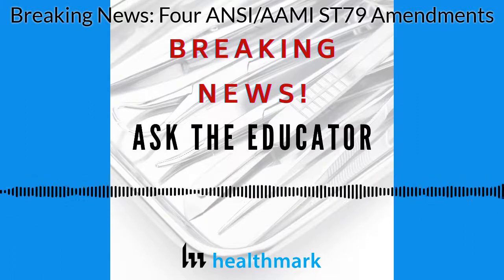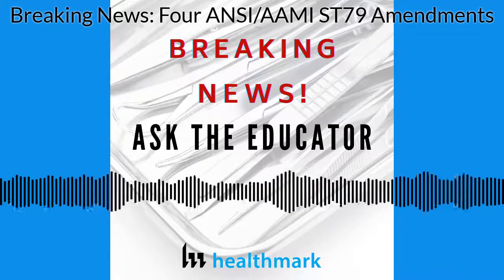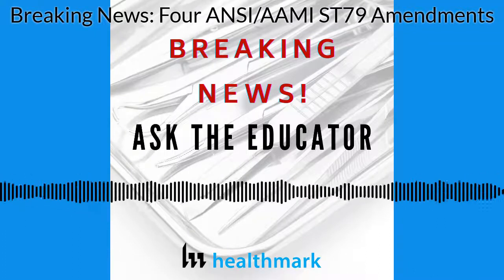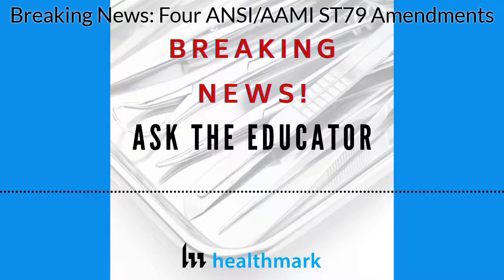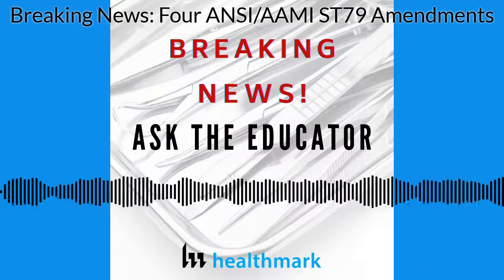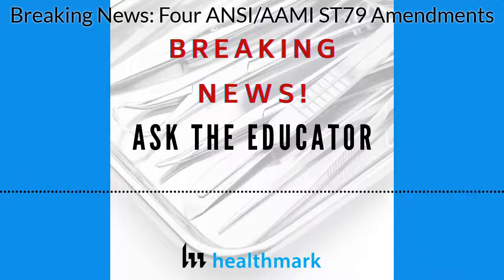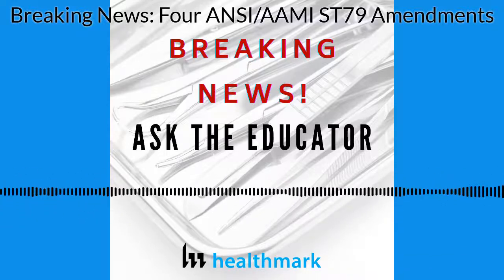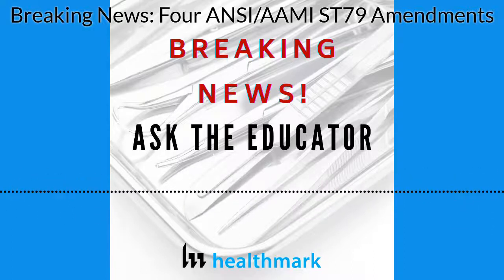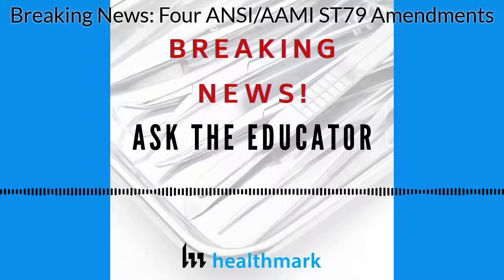And now this brings us to our final amendment, Amendment 4, which has to do with a revision to Section 13.3.3. This amendment is all about lot numbers. All the BI testing that you do, you need to remember to record the lot numbers of all the BIs and all of the controls. This shouldn't be a major change to current practice, as the controls should be from the same lot as your BI anyway, but one you want to be sure that you are documenting going forward.